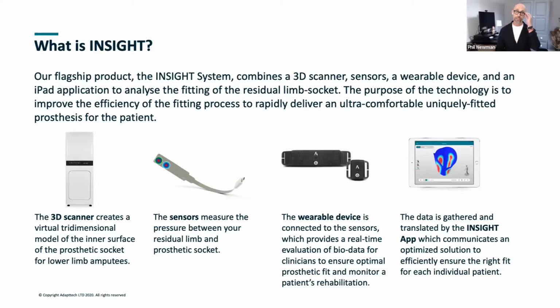So the app, as you can see there, is sitting on an iPad. It is an iPad-specific app, and that is being used by the prosthetists for all sorts of functions, which Fred is going to talk us through today.